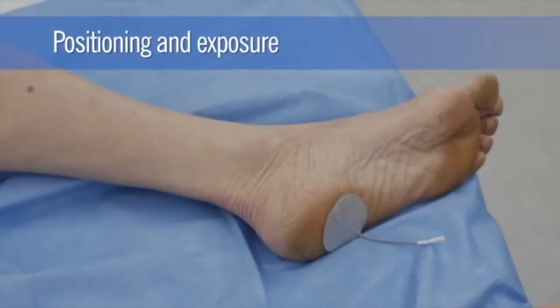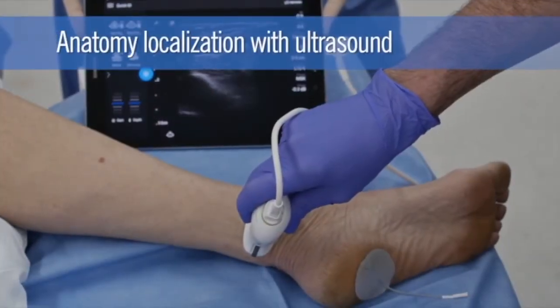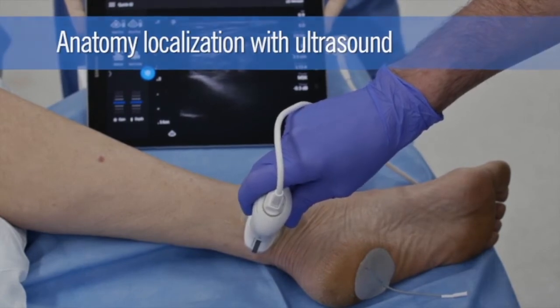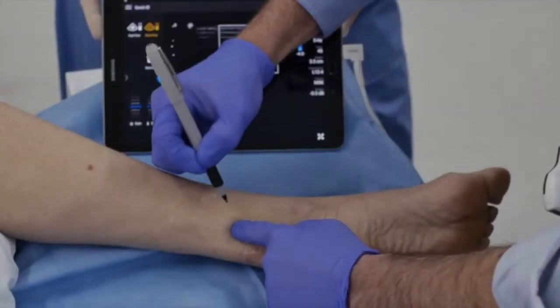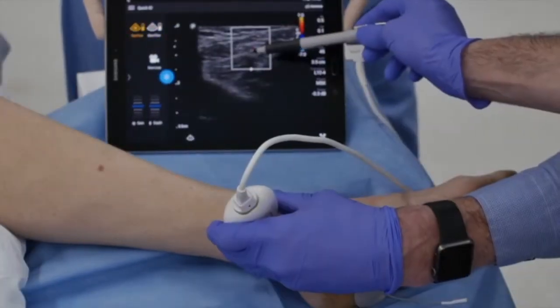The patient is positioned supine and the operative leg is frog-legged slightly. Anatomy localization using ultrasound is optional prior to the start of the procedure. However, examining the patient's unique anatomy and marking the skin above the posterior tibial nerve may help orient the surgeon during later steps.